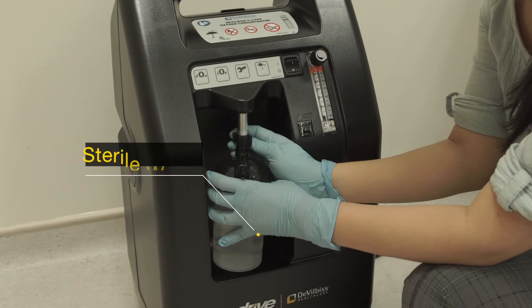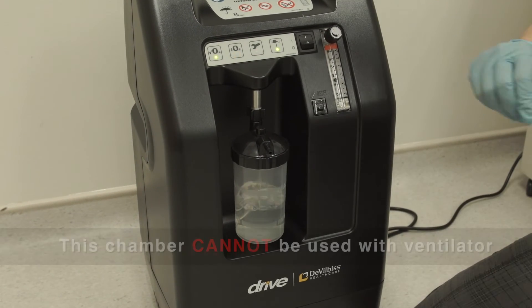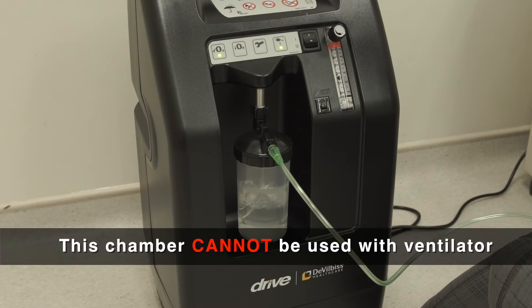An extra humidifier chamber can be attached to the oxygen concentrator when using the trach mask. It cannot be used together with the ventilator, as the moisture in the air will damage the machine.